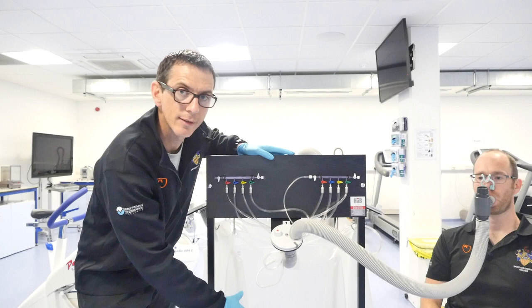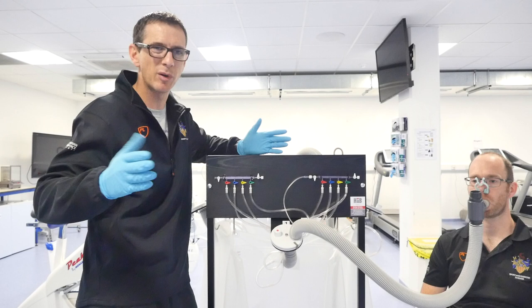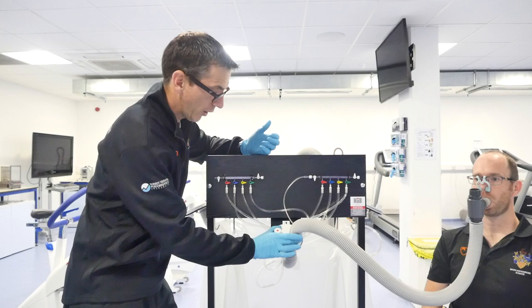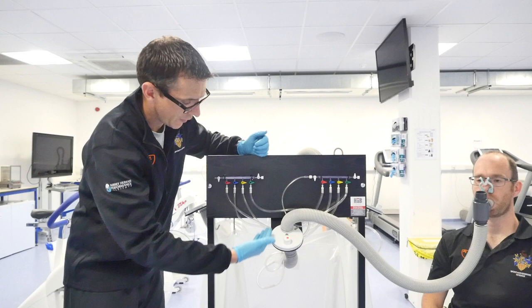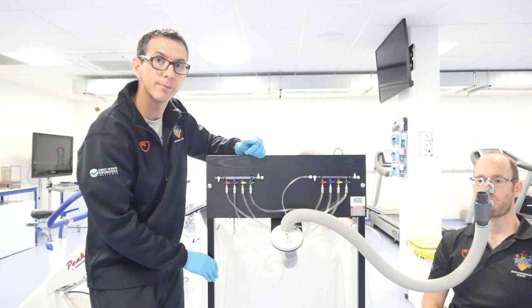It's really important when we collect the gas that we know exactly how long we're collecting it for. Generally we might collect gas for 30 seconds, 45 seconds, with a maximum of 90 seconds to 2 minutes. Once I've got my stopwatch ready so I can record how long I'm collecting gas for, I will then close the disc, start my timer, and now the participant's breathing out - all the gas is getting collected into the Douglas bag itself. I know because my valves are all closed, the gas is staying within the bag.